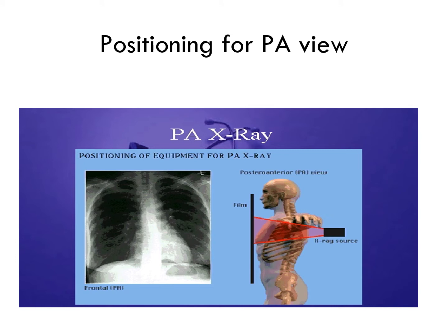Again, here's another picture of it. The other thing they like you to do when they're doing the x-ray is to take a deep breath and hold it. One of the advantages when we're bagging a patient, manually ventilating them, is that we can assist them with that. The x-ray tech might say, "Are you ready?" and then we'll give the bag a good squeeze and hold it for a second while they shoot the film. There's usually a little beep after they've taken the picture, so you know when to stop holding the breath.